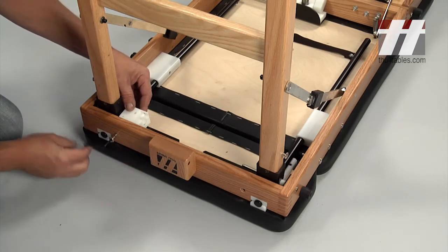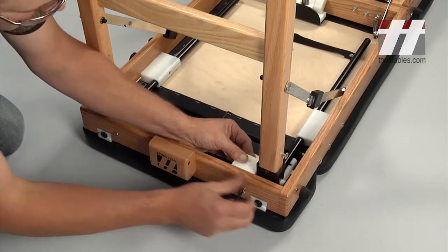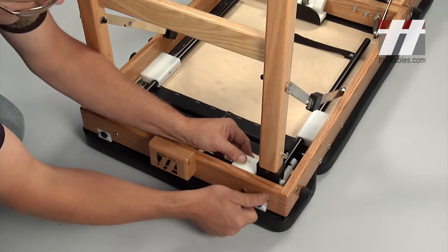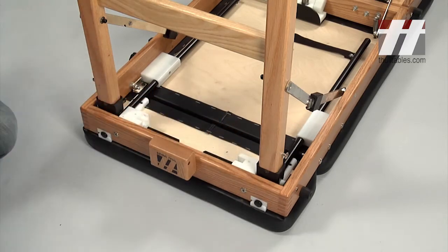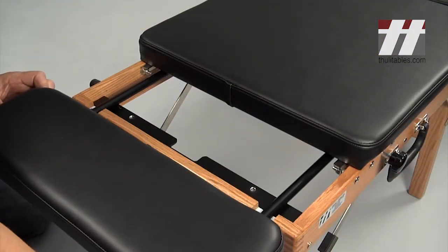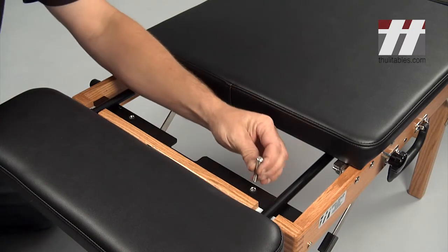Using the two screws you've removed from the leg blocks, attach the mounting blocks to the mounting angle using the Allen wrench provided. Extend the ankle rest. Secure the mounting blocks to the mounting angle using the Allen wrench provided.